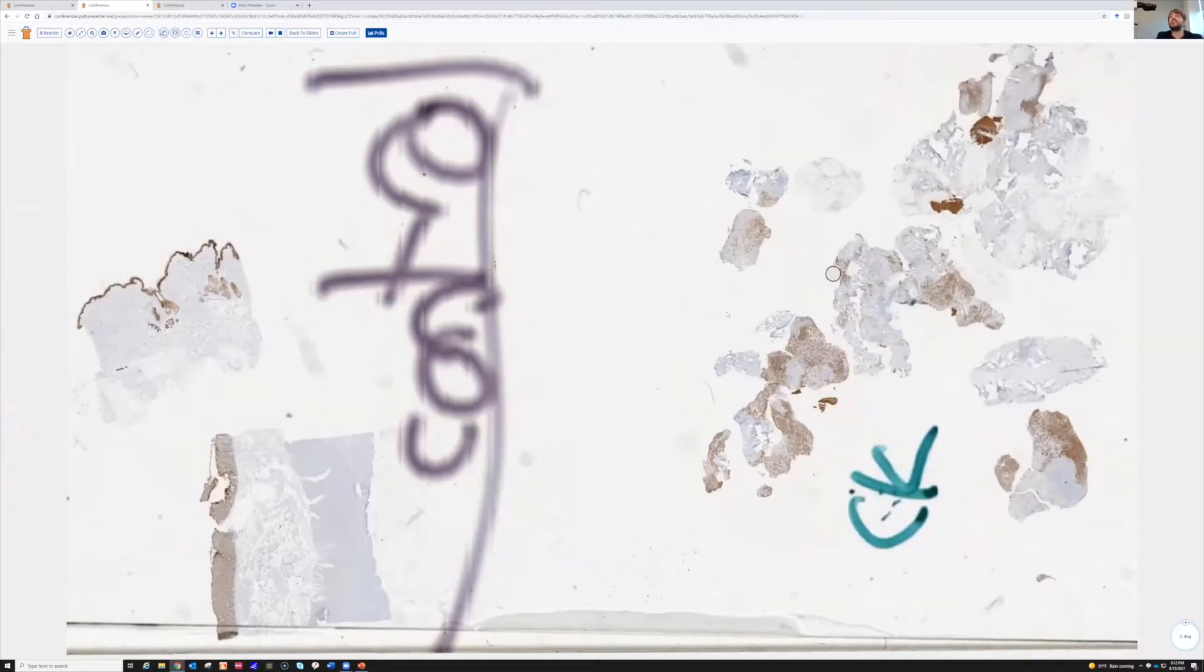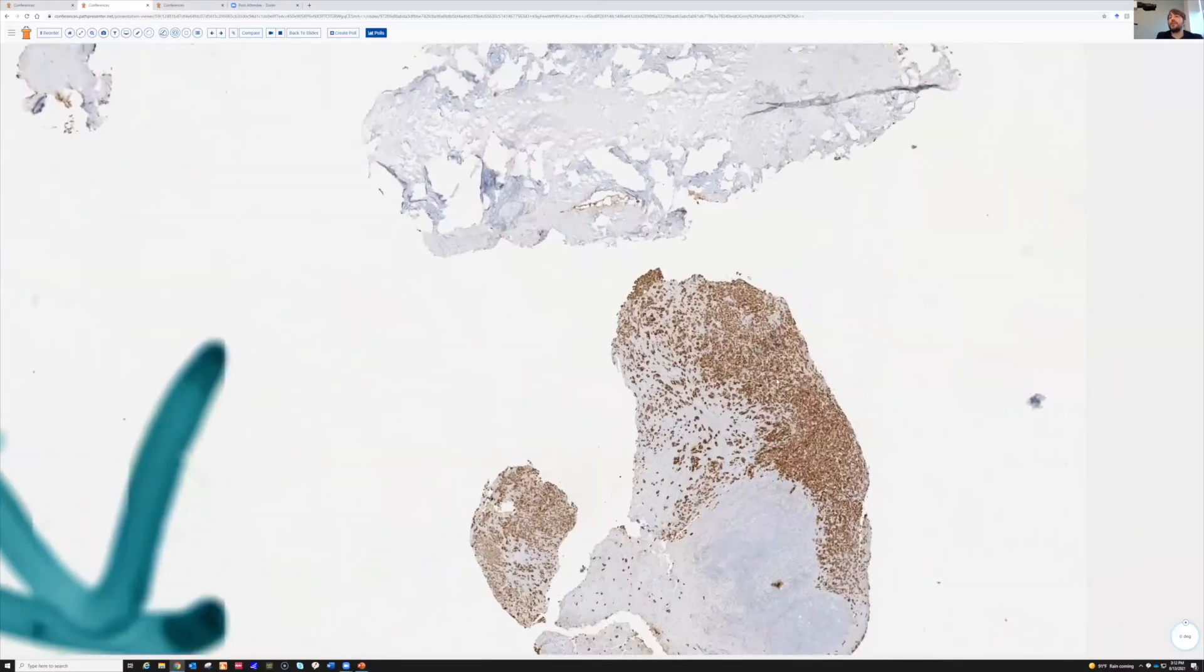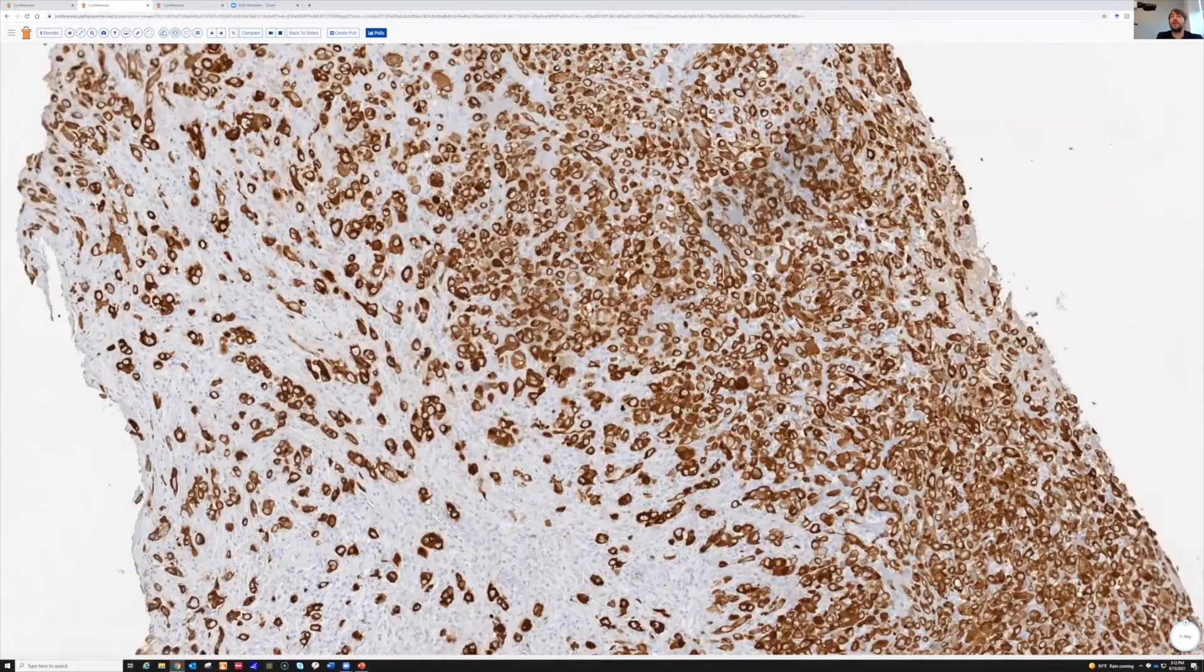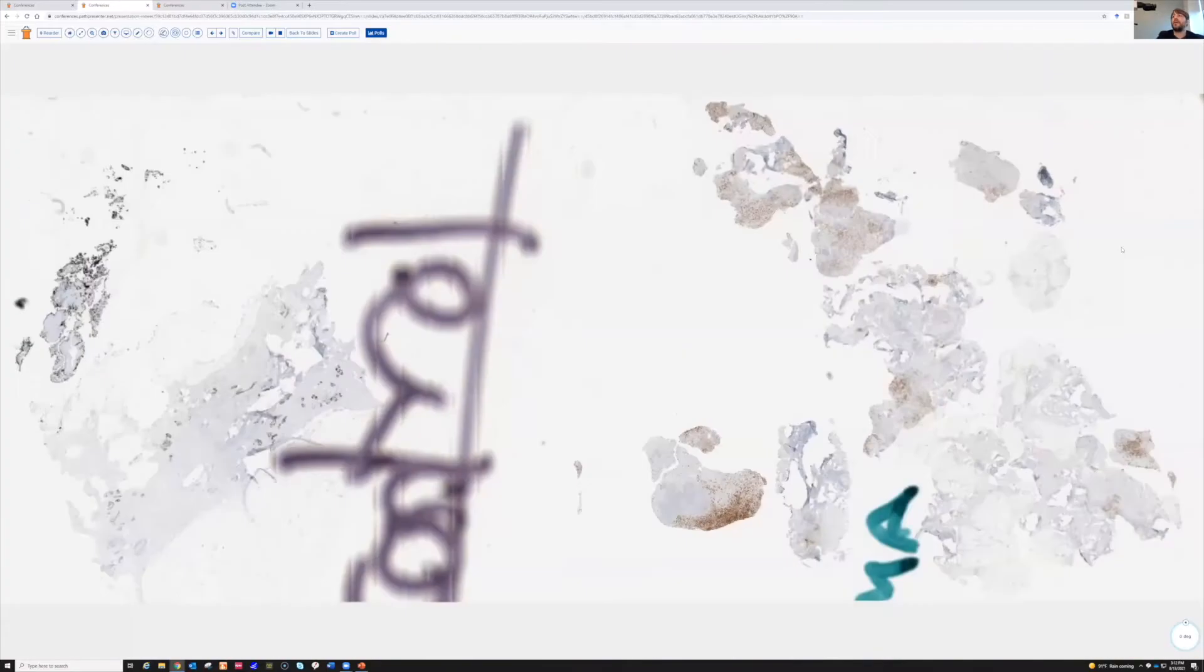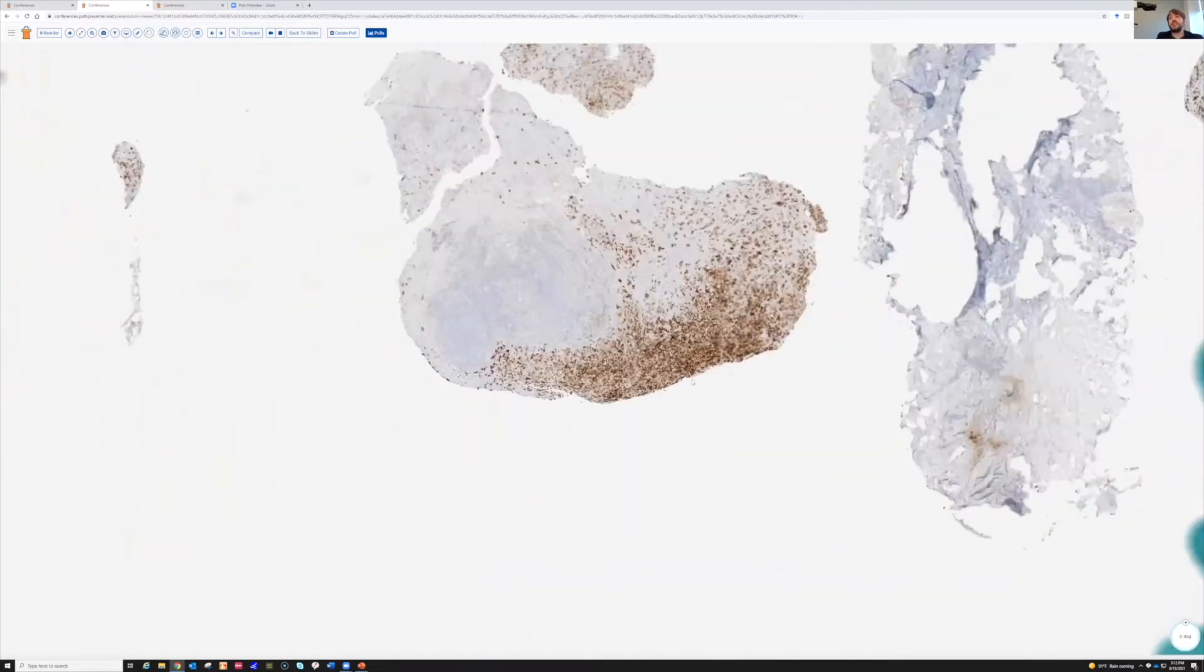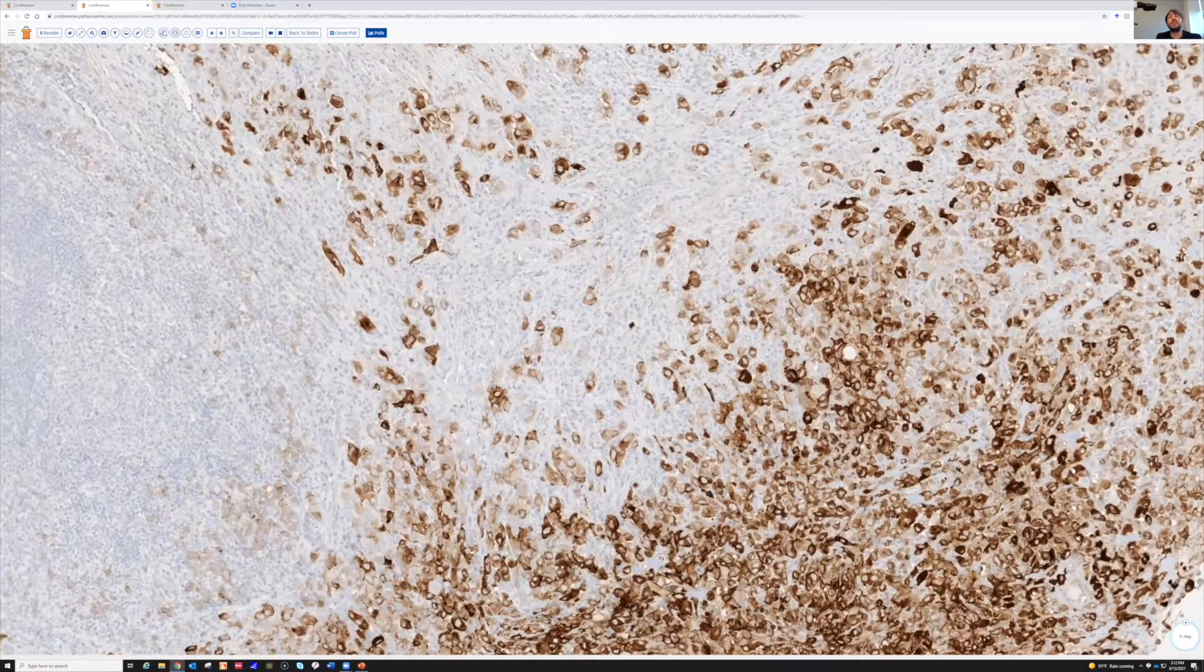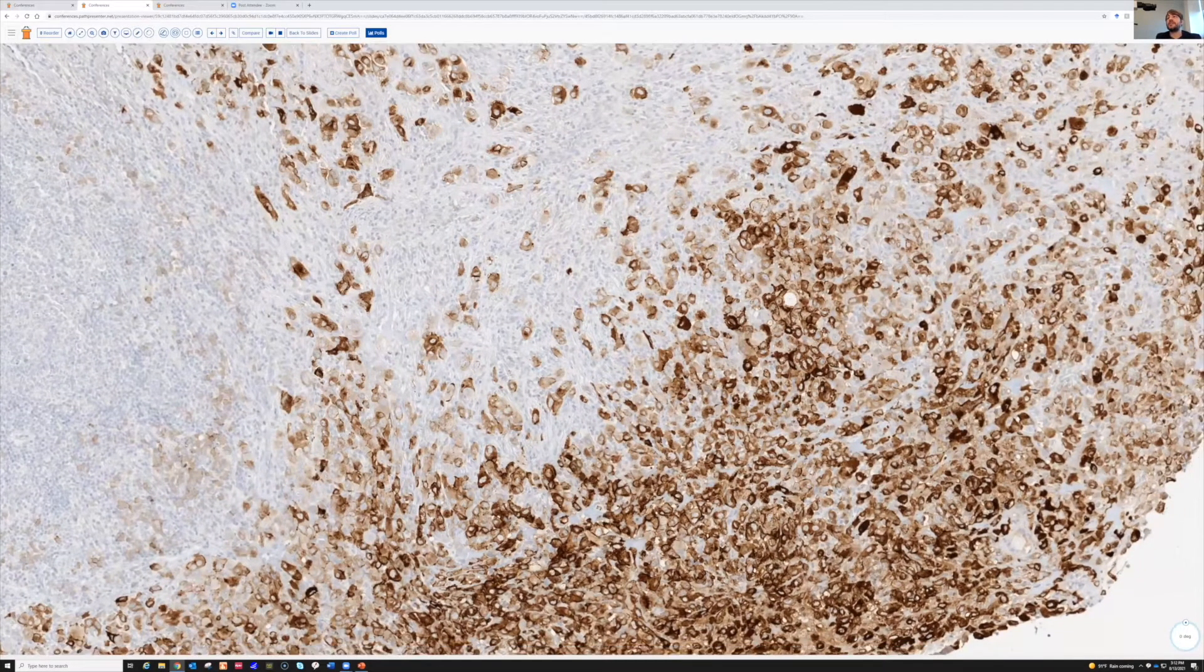Here's a keratin stain. Strong, diffuse expression of pancytokeratin in the cytoplasm there. Here's an EMA. Occasionally keratin doesn't work as well for this tumor, but EMA will, so I feel like it's decent and reasonable to do both of them if you're suspecting this.